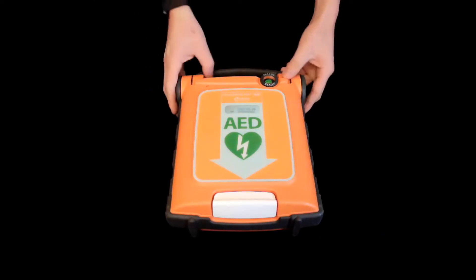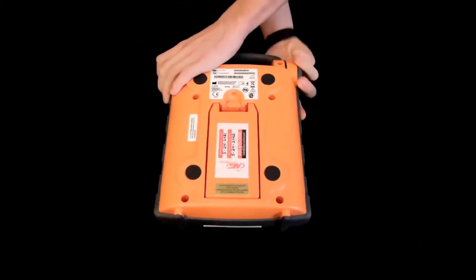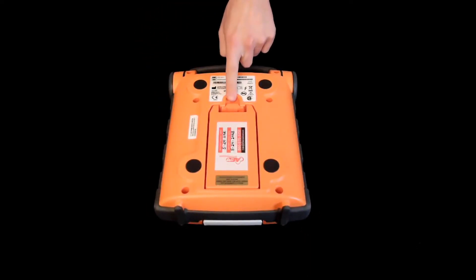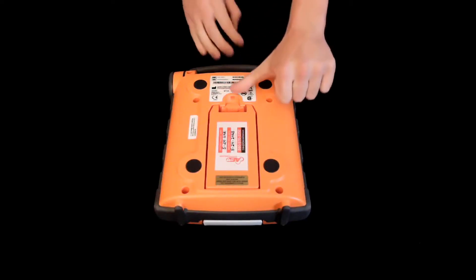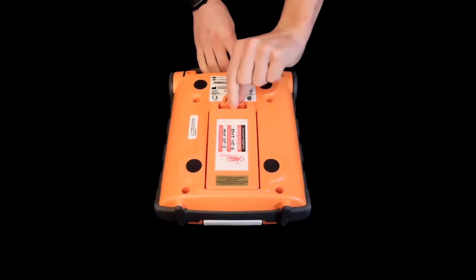Once installing a new battery, flip the AED over. Press down on the clip at the top of the battery and the battery will pop right out.